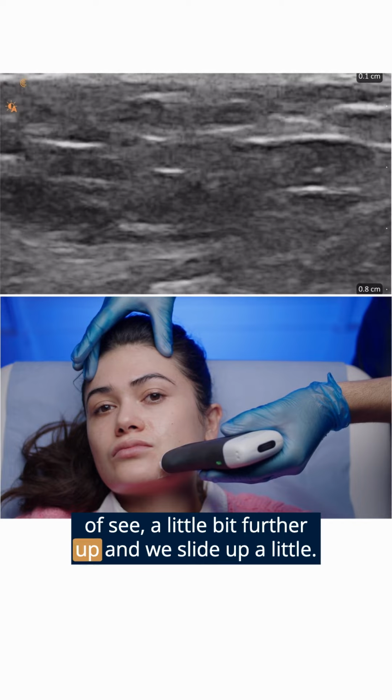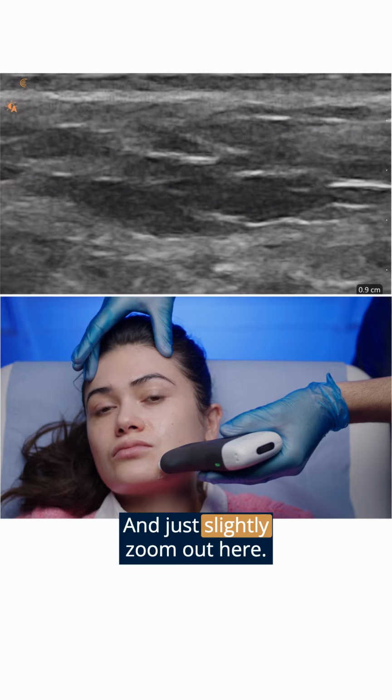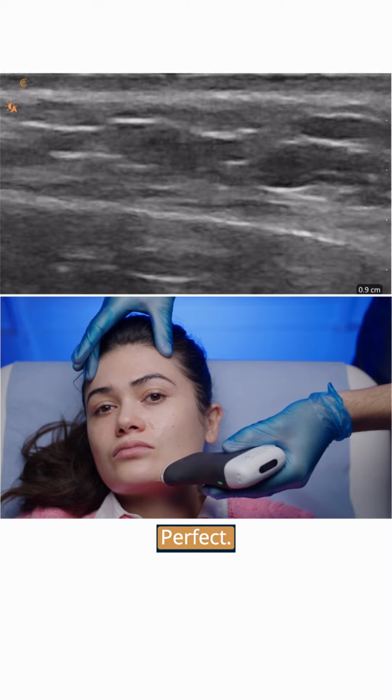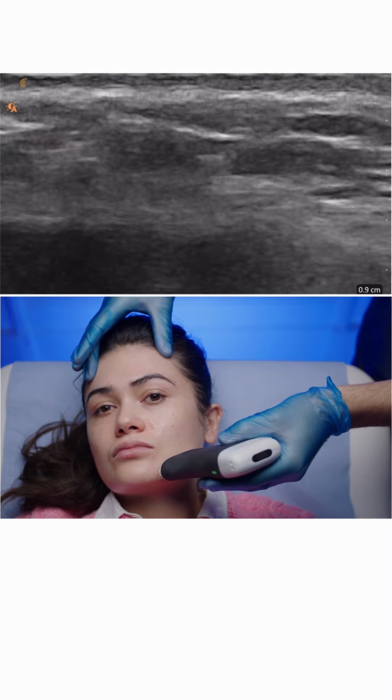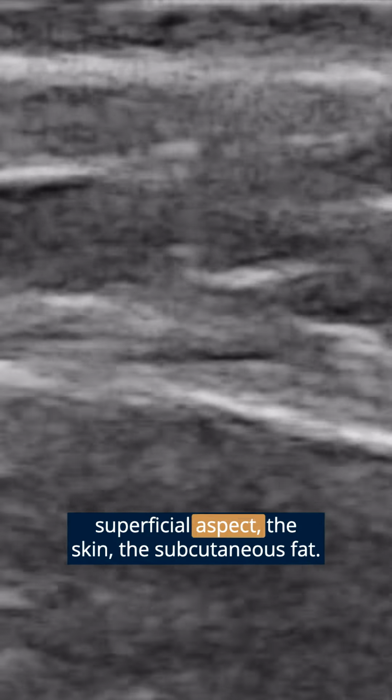If we just zoom in a little bit here, Chris, so we can see a little bit further up, and we slide up a little bit. There we go, and just slightly zoom out here. Perfect. Good. So here we can quite well see from the superficial aspect, the skin, the subcutaneous fat, then the firm hyperechoic structure, which is the mandible.